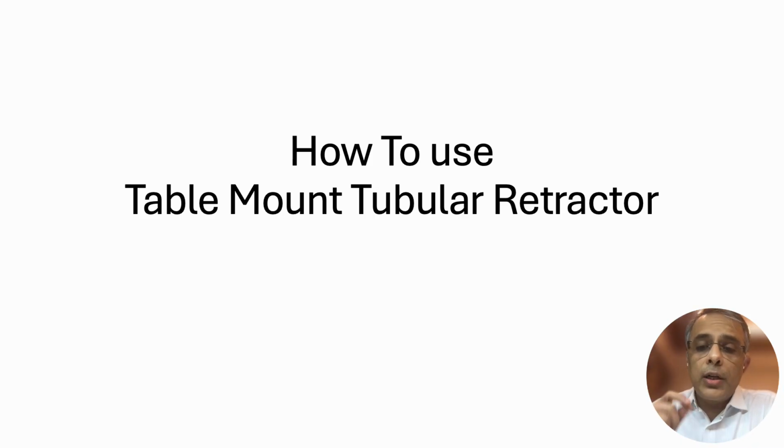Now to do further instrumentation, every time you will have to go through the quadratus lumborum and paraspinal posterior musculature. So instead, what I have started using is a table mount fixed tubular retractor system. Our standard MIS tubular retractor system, 70 millimeter, 19 to 20 millimeter diameter tube, which I dock on the posterolateral aspect of the spine above or posterior to the transverse process, and entire other instrumentation is done from this tube, so that every time I don't have to abrade the muscle fibers by inserting the shaver, cage or other curettes and other instrumentation.